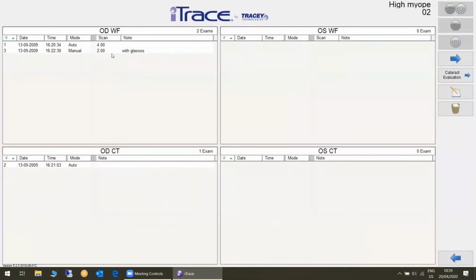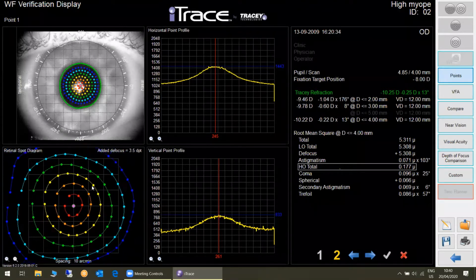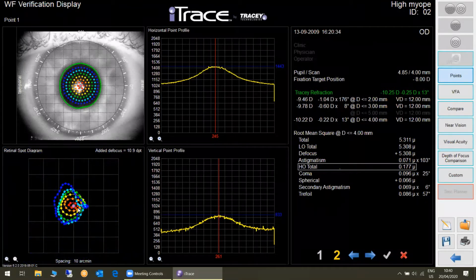But most patients who come to the doctor don't have good vision. You see here, this is not so good. What do we do? We give them glasses. And you see here, I reduce this, and I'm overcorrected, undercorrected, and this here is best corrected, minus 9.5. It means that this is what the autorefractor would give you, minus 10.5 or 10.4. This is the objective refraction, and this here is the subjective.